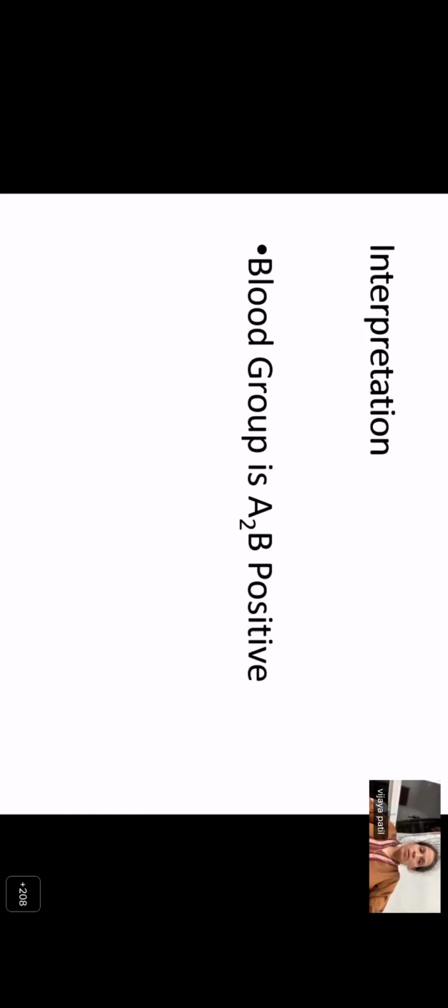Right. Yeah, so that's very important. If you are dealing with a transplant, then definitely this would be a hospital-based blood center, right? In all hospital-based blood centers, they definitely do a forward as well as reverse blood group. So the chances that this will be missed are very, very less. The only thing is, as a donor, as a normal individual, we may get our blood groups done at a pathology laboratory also, along with our other tests, and they may do it on a slide and not do a reverse blood grouping. This is where you may be reporting a different blood group. In this case, instead of A2B, it will just be reported as A1B or AB because they have not looked at further testing with the A1 lectin, etc.